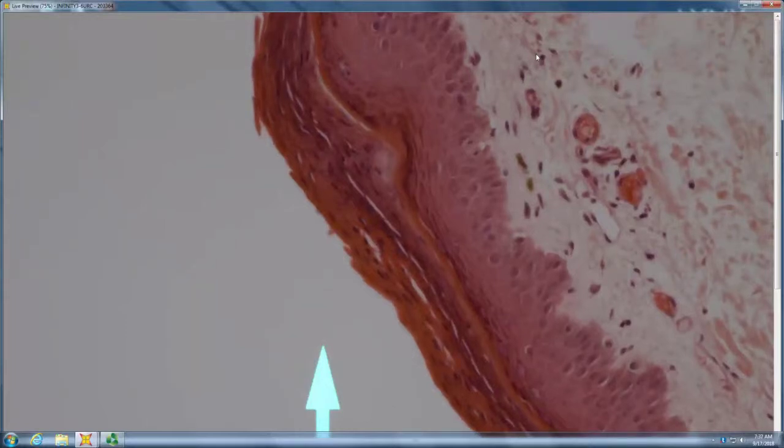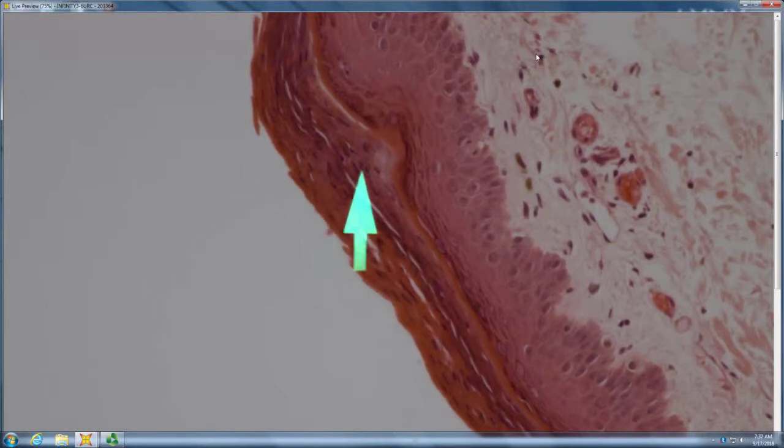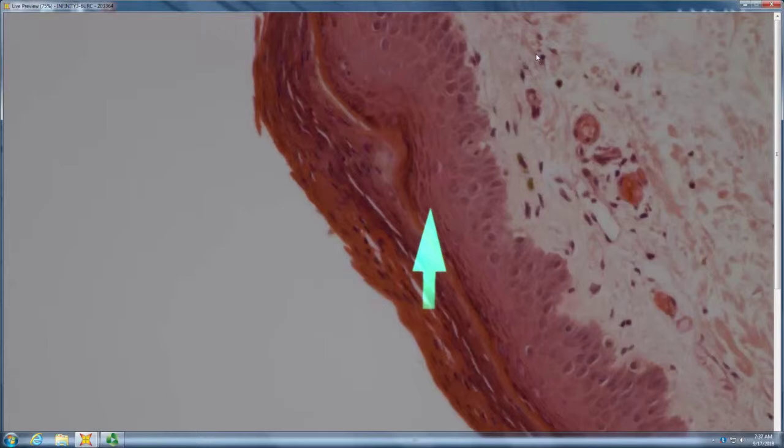Okay. Parakeratosis. There's a little pigment in the papillary dermis. Is that Candida? So you said there's parakeratosis. Is there hyper or hypogranulosis? Hyper, so I guess it should be lost. So this is the granular. And the granules continue all through that parakeratotic layer, so you are correct that it's granular parakeratosis.